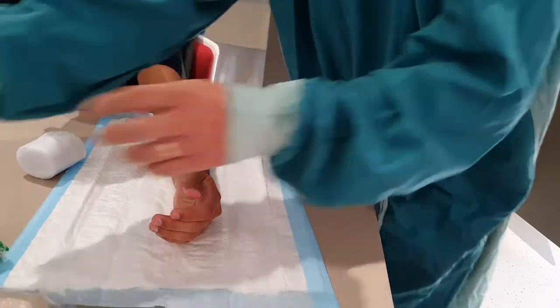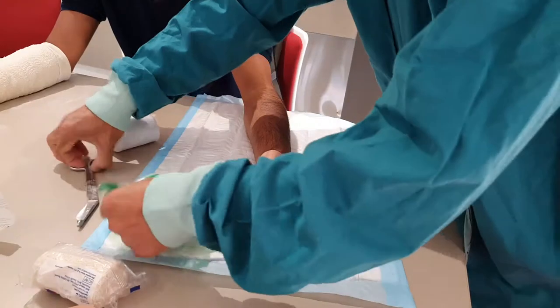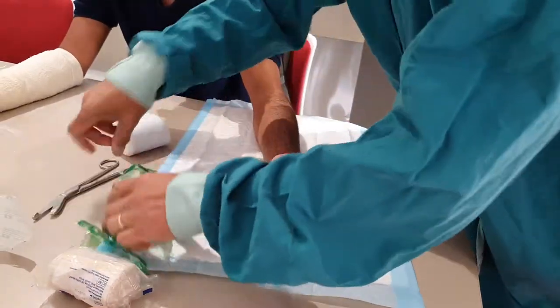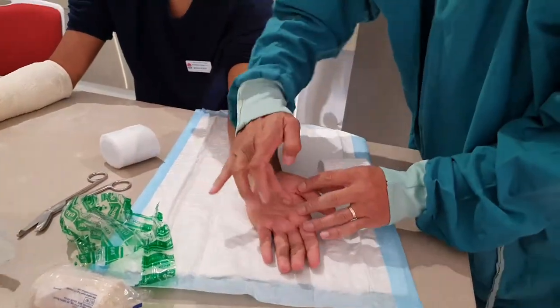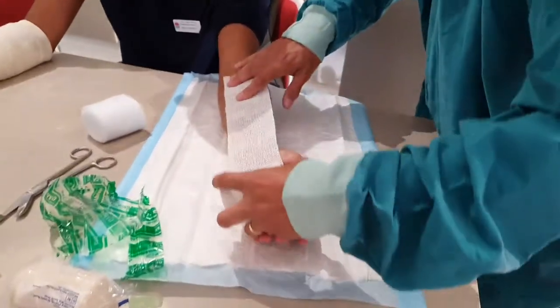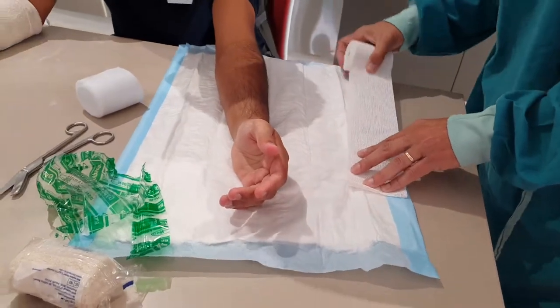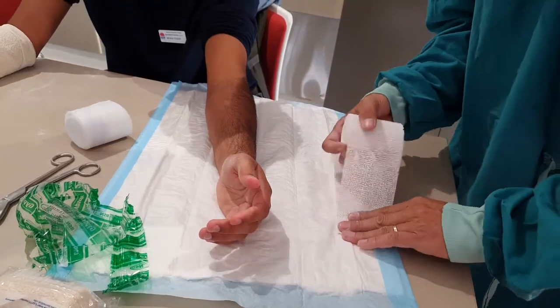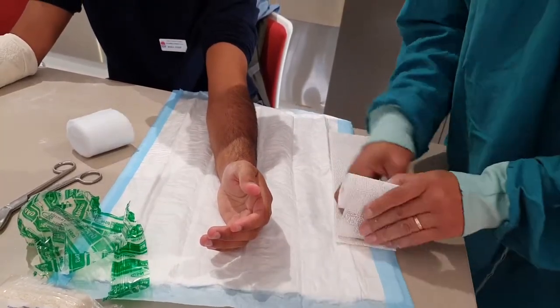First of all, what we need to do is actually measure up the plaster. We take a marking from the crease of the hand, and I like to come in about an inch from the elbow. I'm going to fold it — for the purpose of this video about five times, but ideally I'd like it over eight on a young strapping man like this.